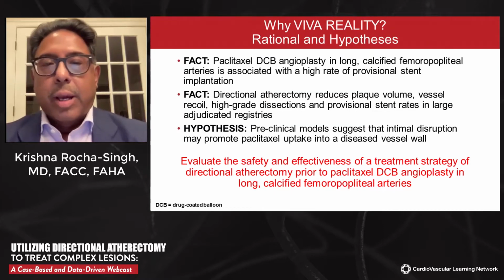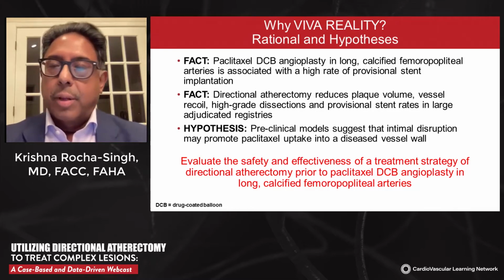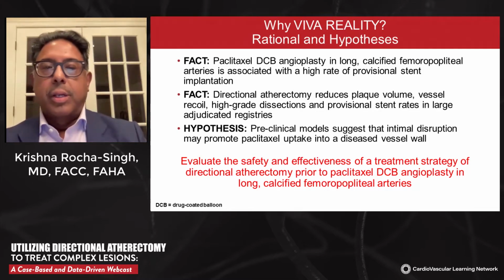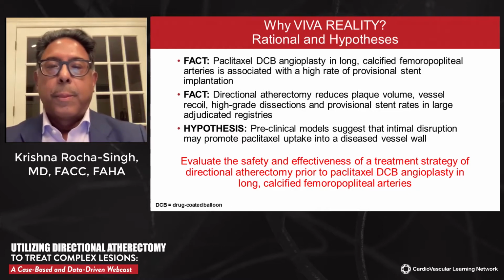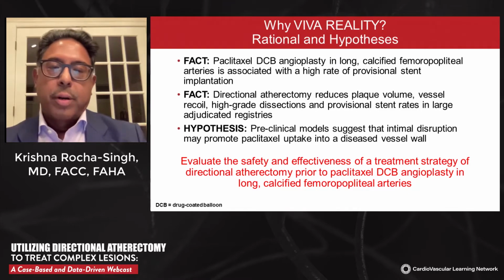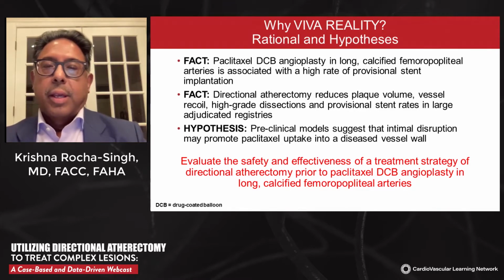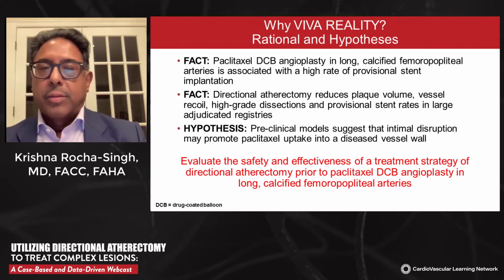The REALITY trial was designed to evaluate some very essential hypotheses as they relate to the treatment of very complex calcified lesions. We understand from adjudicated registries, specifically the imaging cohort from IMPACT SFA, that long calcified lesions, and we'll discuss a little about what calcification means, are associated with high rates of provisional stenting.